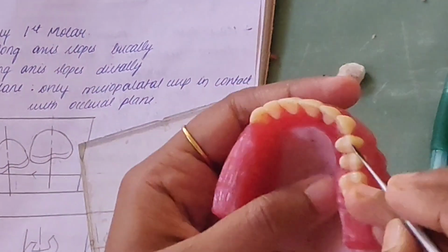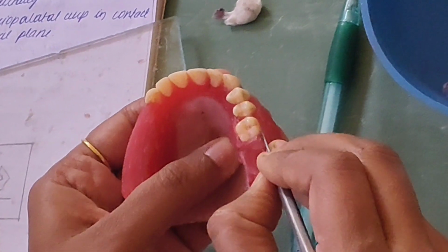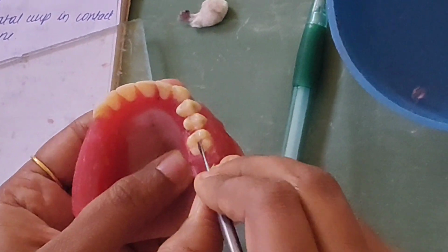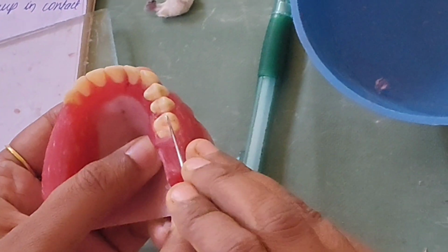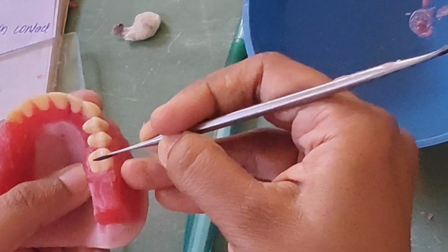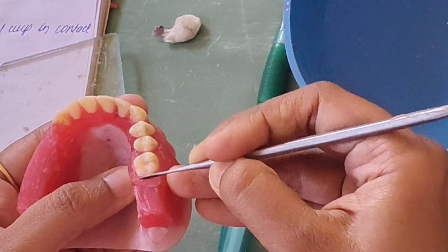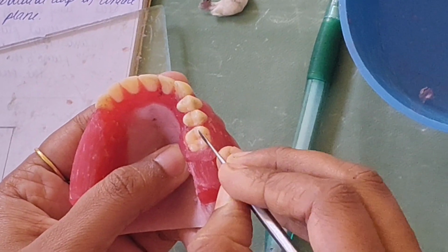What happens? This is the occlusal plane. The occlusal part of the first molar. This is the buccal side. This is the palatal side. This is the mesial side. This is the distal side. So buccal and mesial: mesio-buccal.